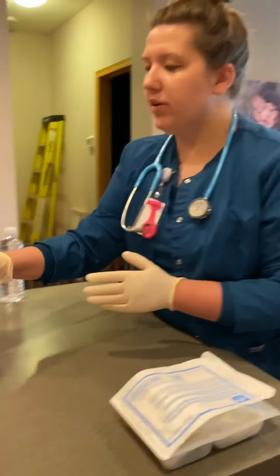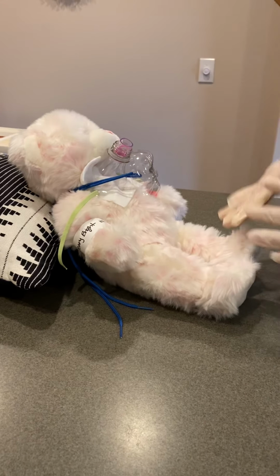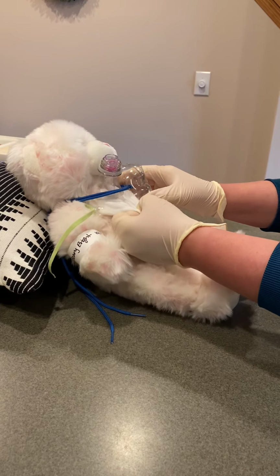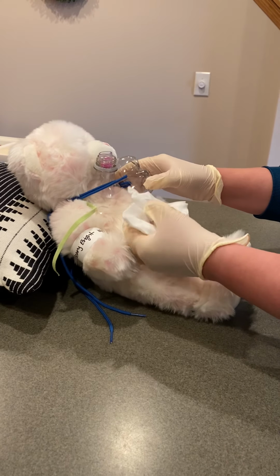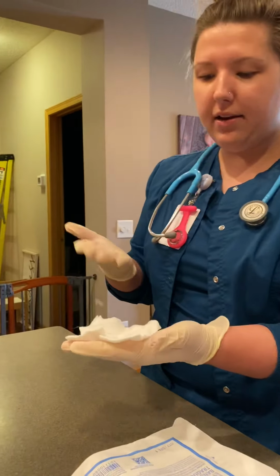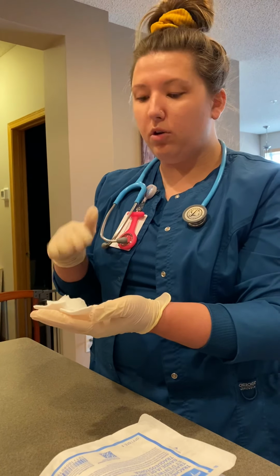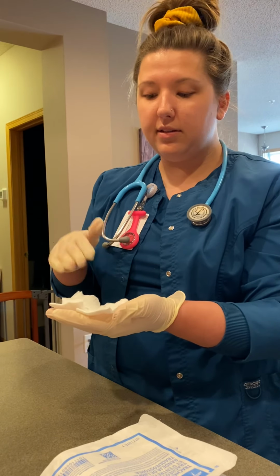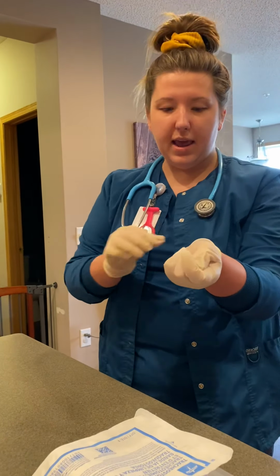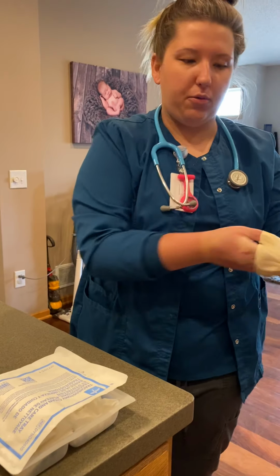Okay, so now I'm going to remove the oxygen here, and well, I would be doing this while I'm taking out the dressing. So I'm going to take out the dressing under the trach here and put it in my hand, and then I'm going to replace the oxygen back on. And while this dressing is in my hand, I'm going to be assessing for secretions. I want to note the amount, the consistency, color, and odor. Okay, so now that I did that, I'm going to wrap it in my hand, and then I'm going to discard. So I'll wrap it up, and I'm going to throw it out.